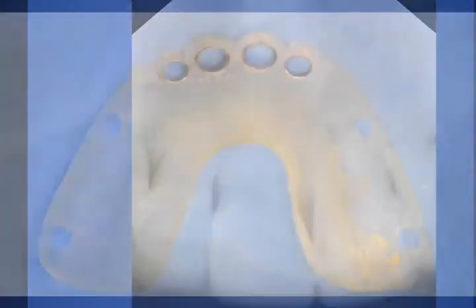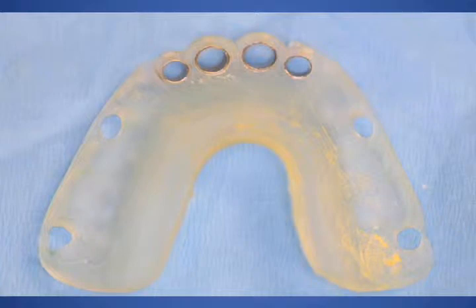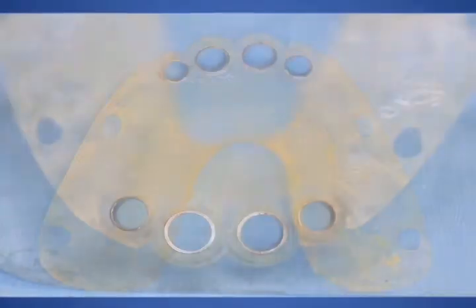But first and foremost, we had to design a surgical guide that would allow us to correctly place the Nobel Replace Select dental implants in a relatively tight area.